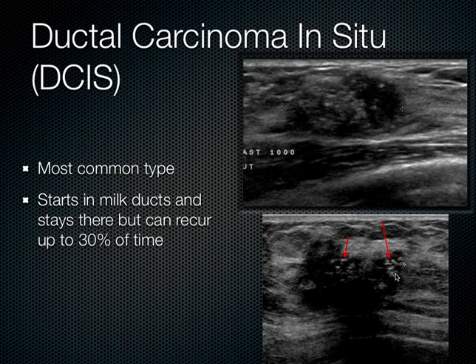carcinoma in situ, and more importantly, it should be distinguished as a clearly malignant lesion, which these are. And so ductal epithelial cells basically undergo malignant transformation and proliferate intraluminally. Eventually the cells outstrip their blood supply and become necrotic centrally. This debris calcifies and is what is detected on both ultrasound and mammography.